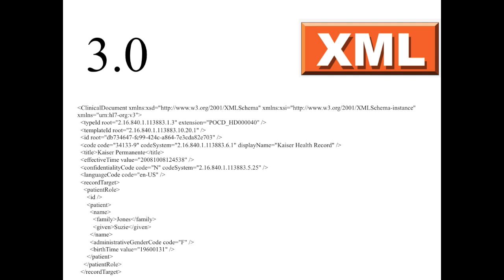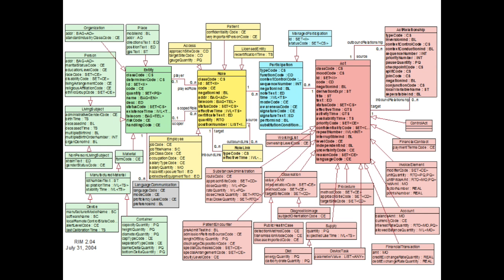However, I will tell you that for the large majority of production interfaces in any given clinical environment today, the majority are version 2. And that's because, as you can see, the messages are completely different, and so they're not compatible, much like USB 3.0 and USB 2.0 might be.